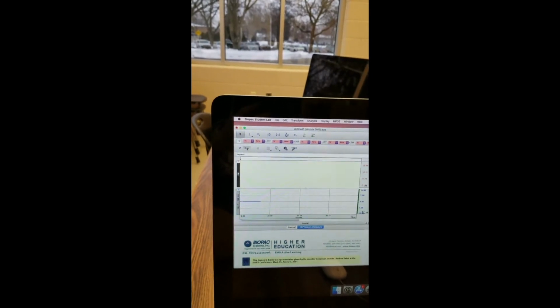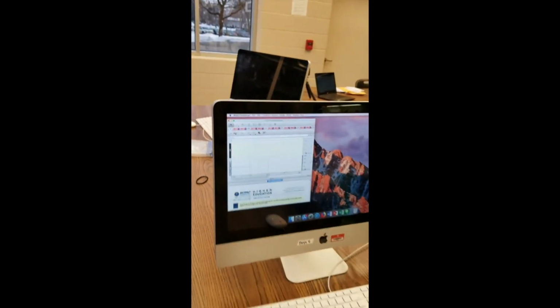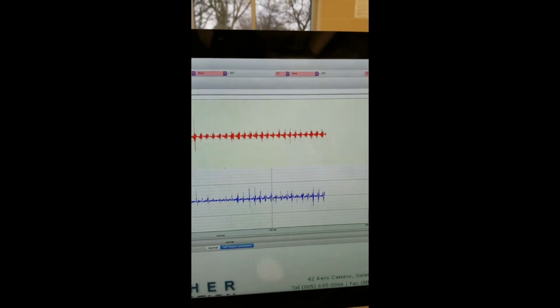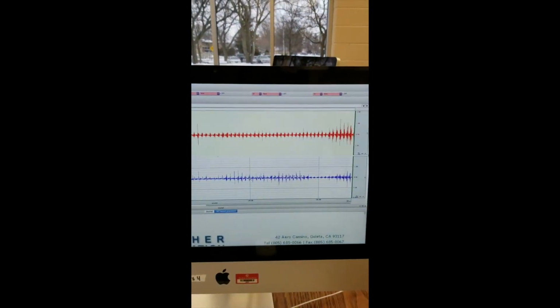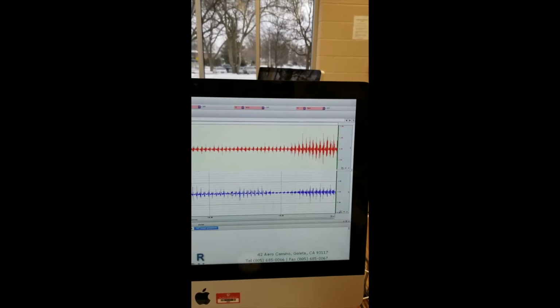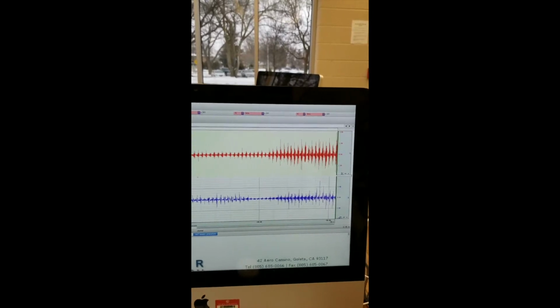Now, what we're going to do is we're going to have people perform activities. In the example later on, we're going to have someone ride on the bike. Dr. Montoya will ride on the bike. And you should see changes in the EMG levels of each muscle. Take a little pause. We wrap some ACE bandages around to hold on to the electrodes as Dr. Montoya cycles. And now we can see this beautiful plot of the EMGs. In the red on the top, we have the quadriceps. In the blue on the bottom, we have the hamstrings. We're increasing the intensity a little bit. And now you can see what happens to the EMG traces. They get larger, which indicates greater electrical activity in those muscle groups or greater activation of muscle fibers.